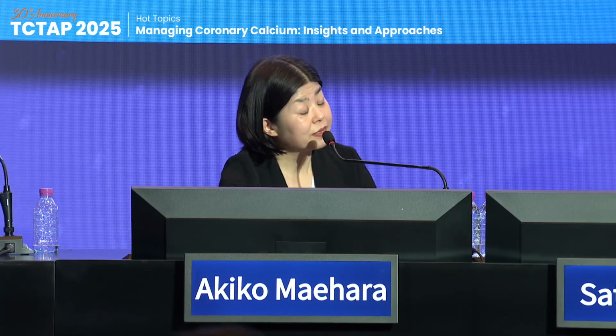In your trial, in a subgroup analysis, in the OCT guided group, is the orbital atherectomy significantly reducing MACE compared to the conventional group? No? So no difference in MACE, but Akiko can comment a little bit because she actually just submitted that manuscript looking at the OCT analysis of what exactly was found. Yeah, the event rate is the same. But I think compared to the non-OCT cohort, the event rate is almost half.